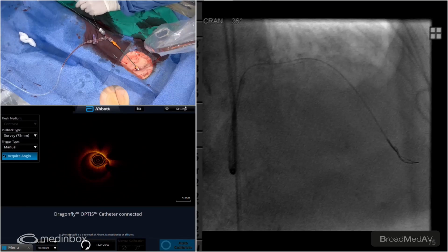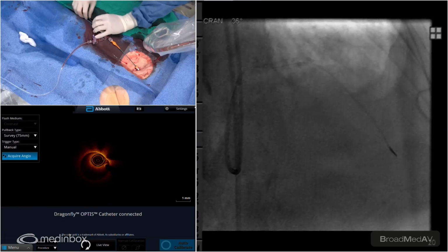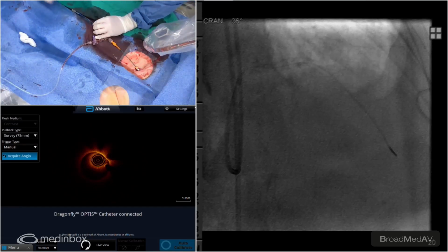Okay, we could probably get the trapper off. This guy's long enough. Let's do it. You can get the trapper down. Okay. You want to walk it out? Let me just make sure I don't pull anything else out. There we go. Okay. I'll give it some de-airing. I'll give this to you here, Sheila. De-air the system. Every time, we always de-air the system after the trapper comes out, as it does pull in air.